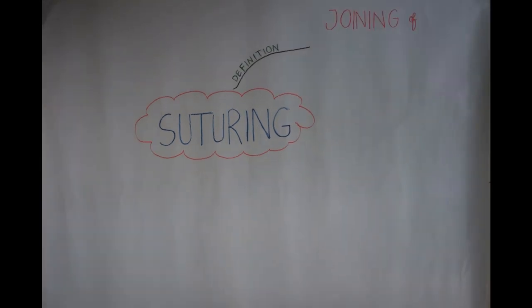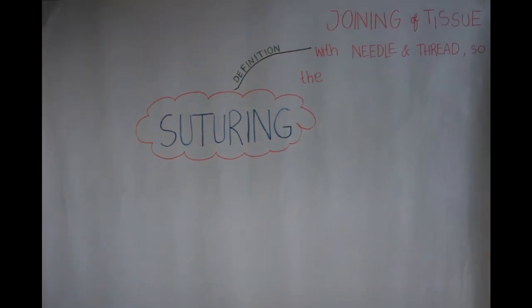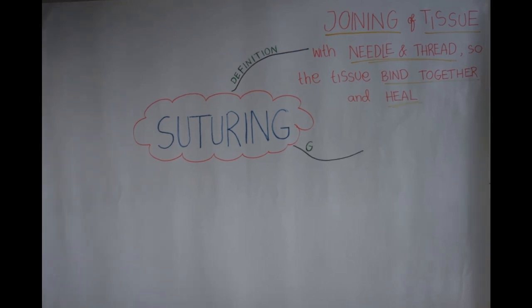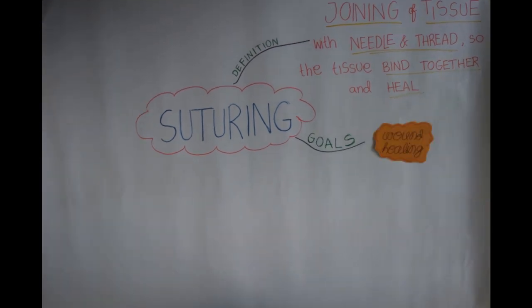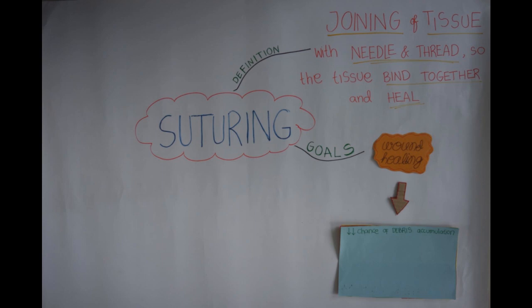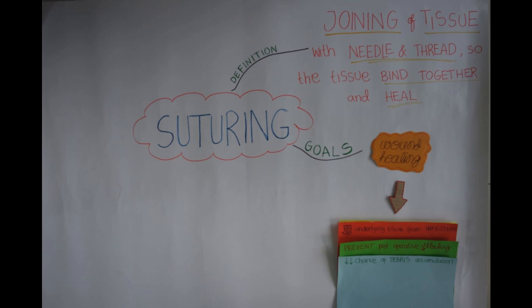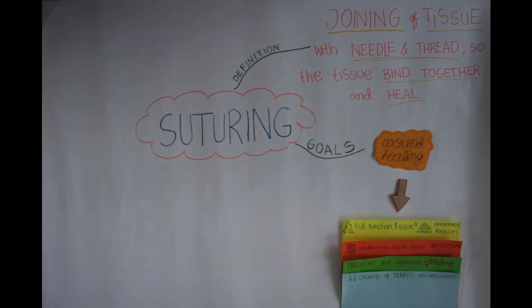Suturing is a joining process of tissue using a needle and a suture material so the tissue binds together and heals. The goals of suturing are to aid healing, decrease the chance of debris accumulation, prevent post-operative bleeding, protect underlying tissue from infection, restore full function of the tissue, and re-establish anatomical position.